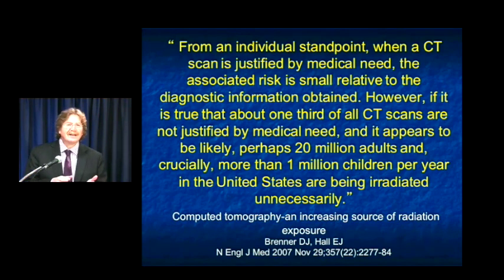Now, where exactly did you get these numbers and 1/3 of all CT scans are not justified? That was a real surprising article in the New England Journal of Medicine, which tends to focus on science. This was like a political statement. But nevertheless, it was picked up by all of the newspapers, and it really did make us refocus. So I guess that's the positive thing, on making certain that our scanners were delivering the lowest dose possible.